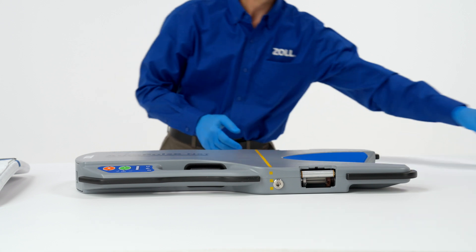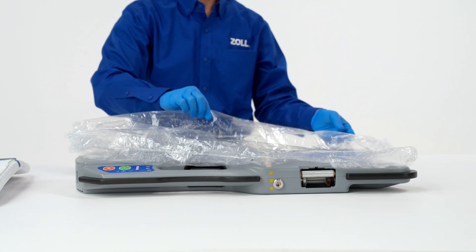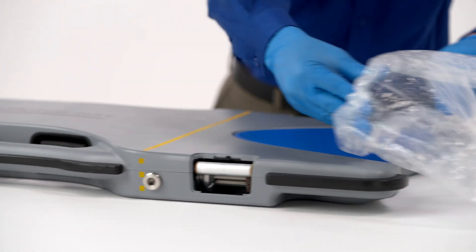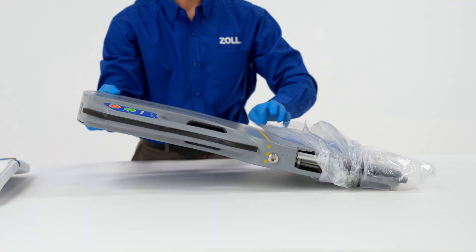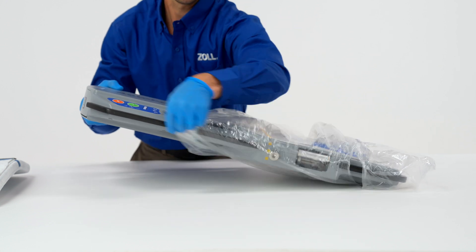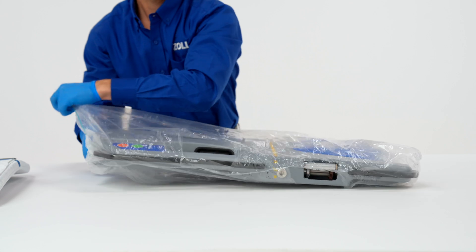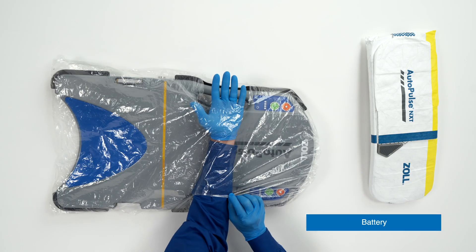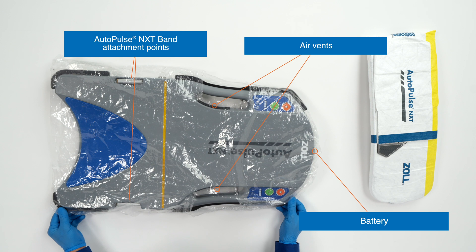Place the hygiene barrier on the platform prior to installing a new AutoPulse NXT band. To install the hygiene barrier, slip it over the bottom of the platform and extend it to cover the entire platform. Align the openings in the hygiene barrier with the battery, air vents, and AutoPulse NXT band attachment points.